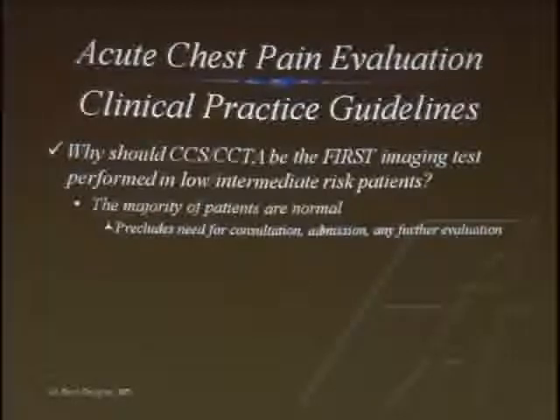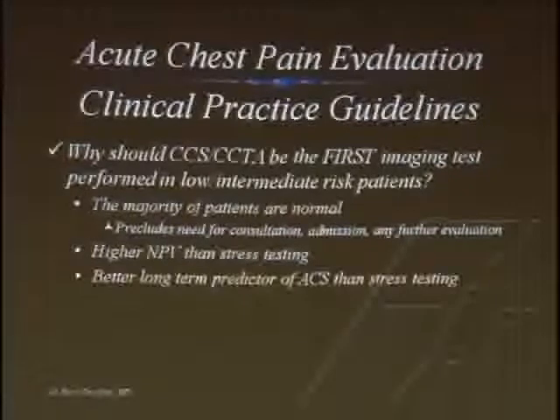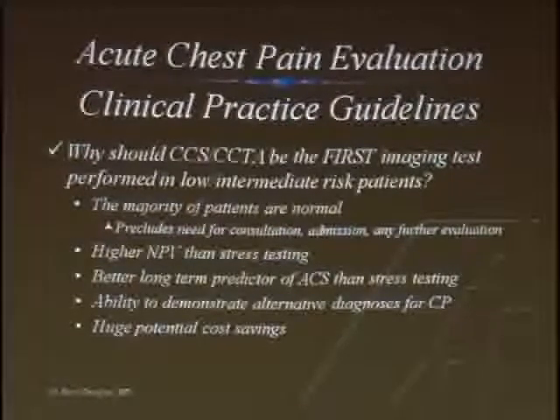And again, if you pick out the ones that are likely to be normal, I think you have a great chance to save money. Very high negative predictive value, and long-term risk stratification better than stress testing. And we can diagnose pneumonia, rib fracture, other causes of chest pain.